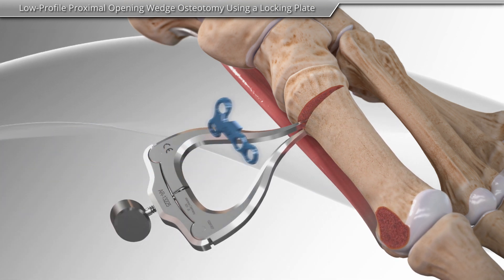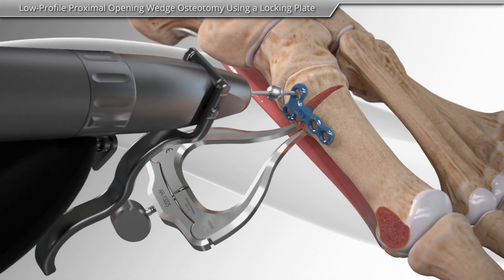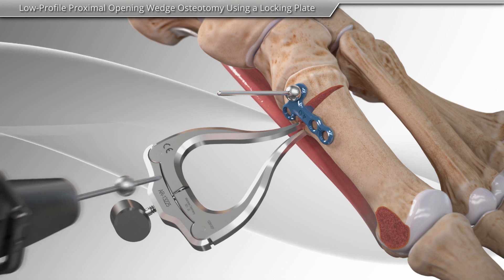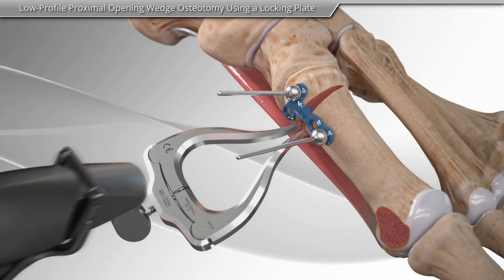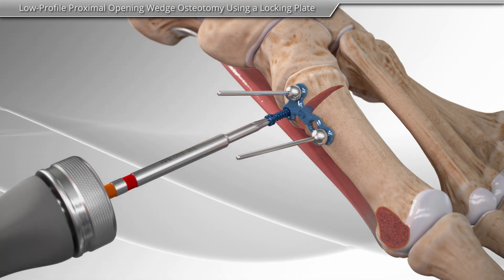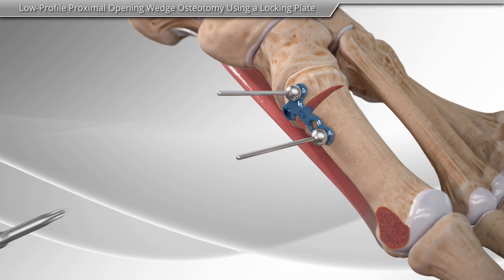Next, the locking plate is placed onto the bone and held into place with pins. Using specific instruments, the bones are prepared for placement of the screws. These specific screws are designed to lock into the plate.